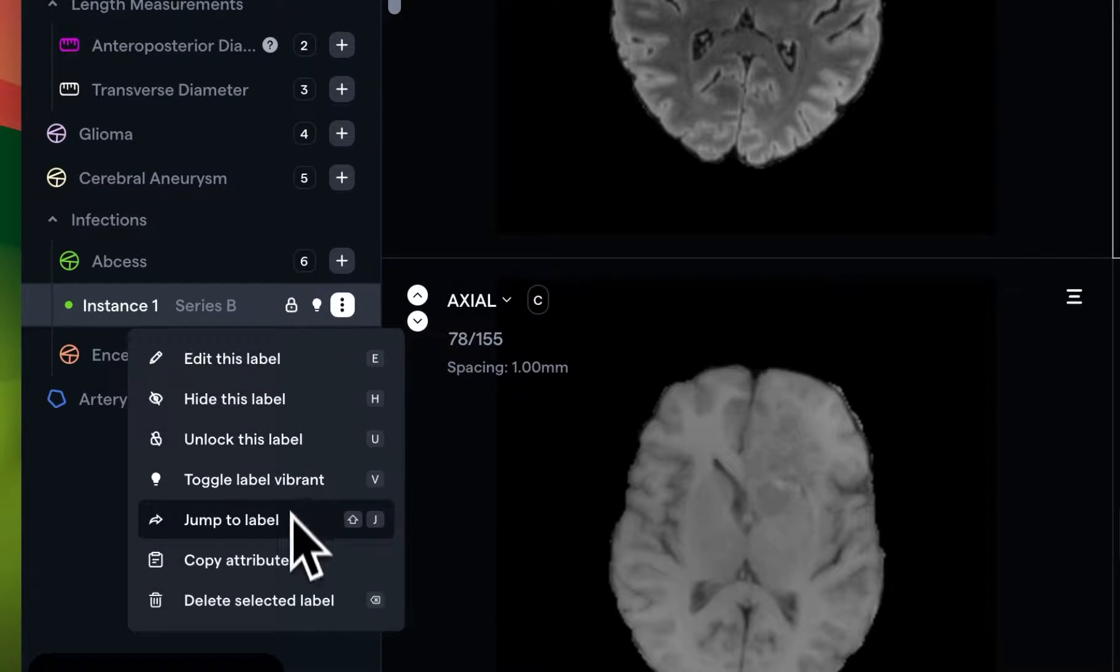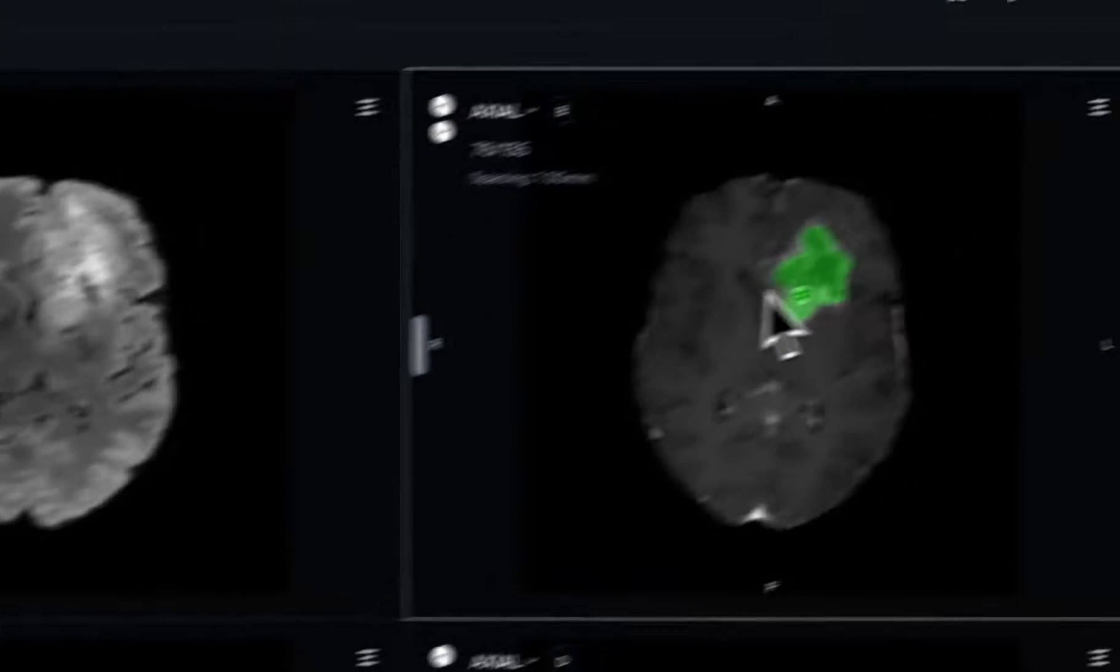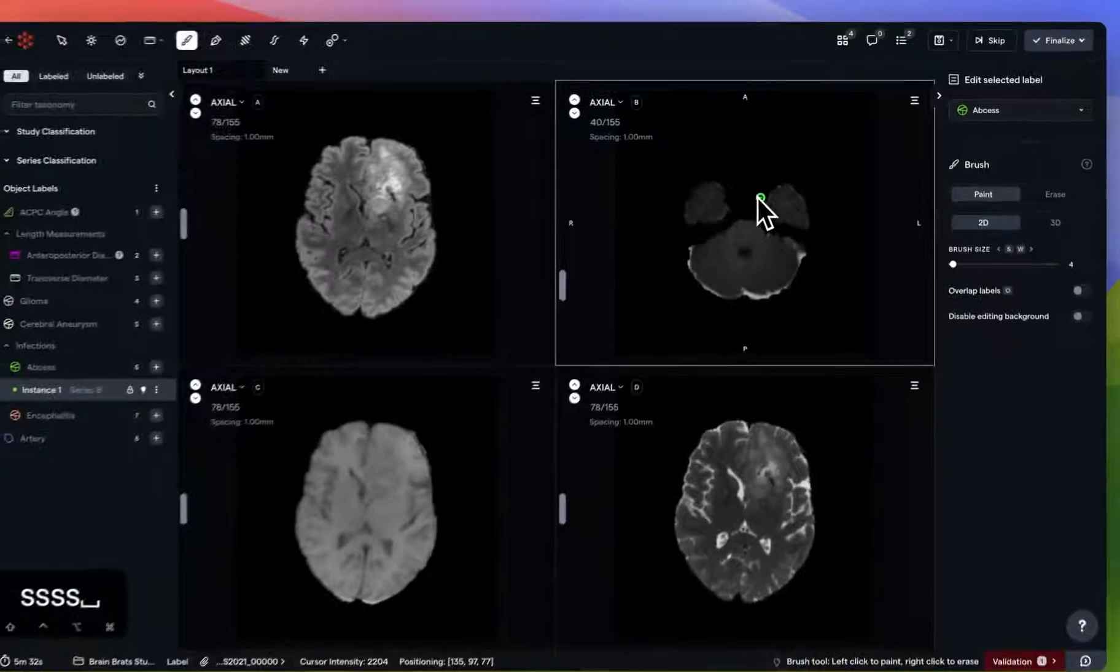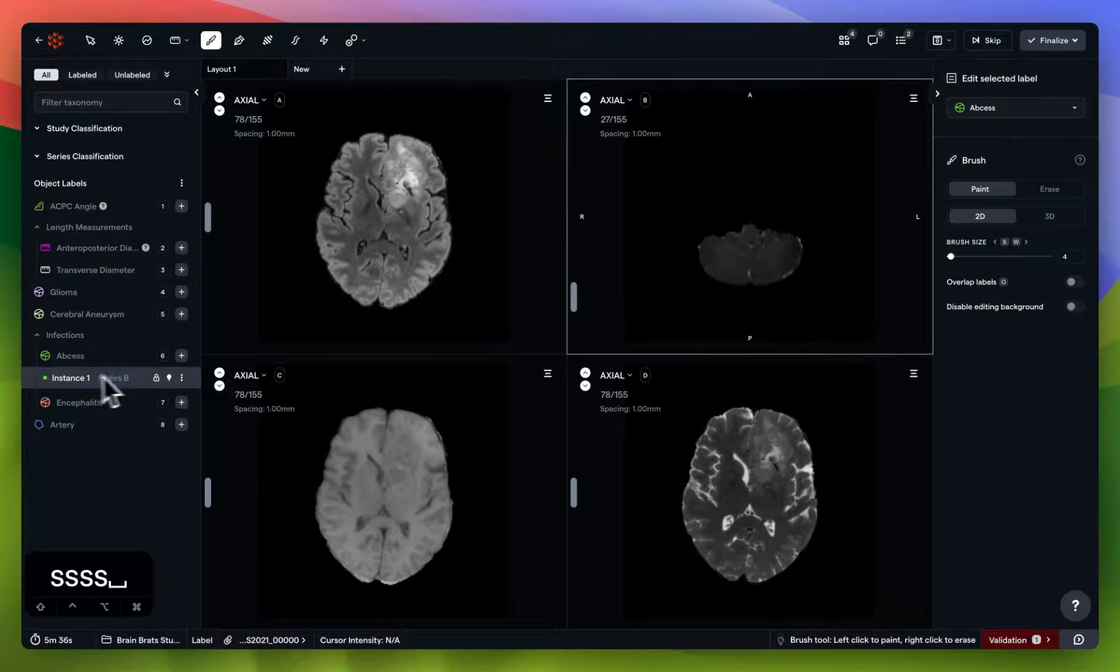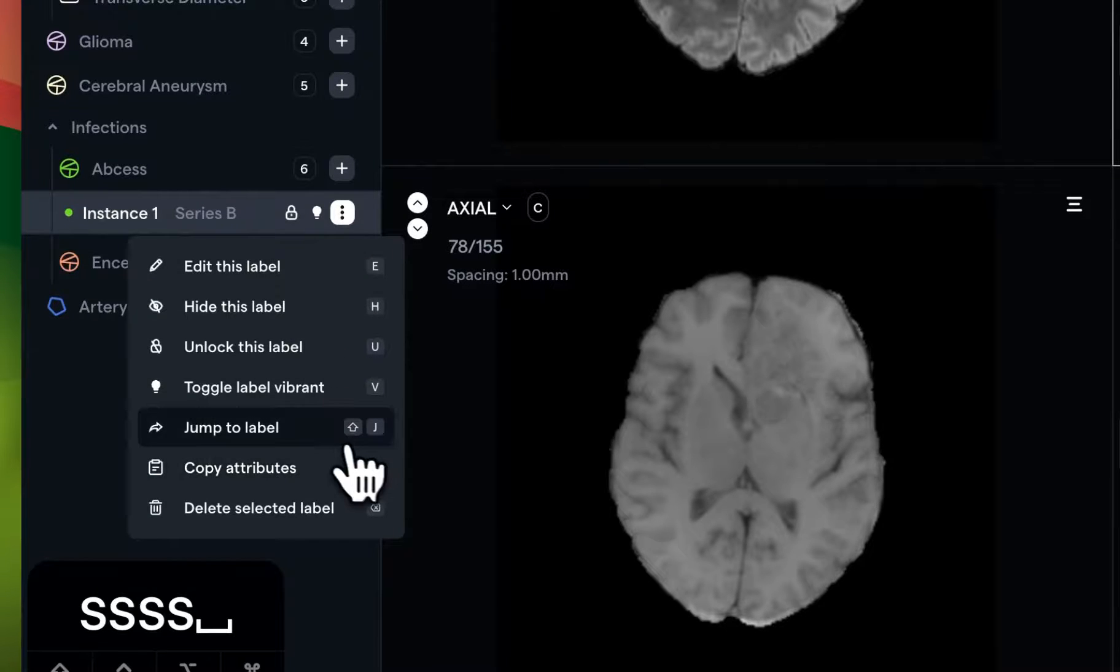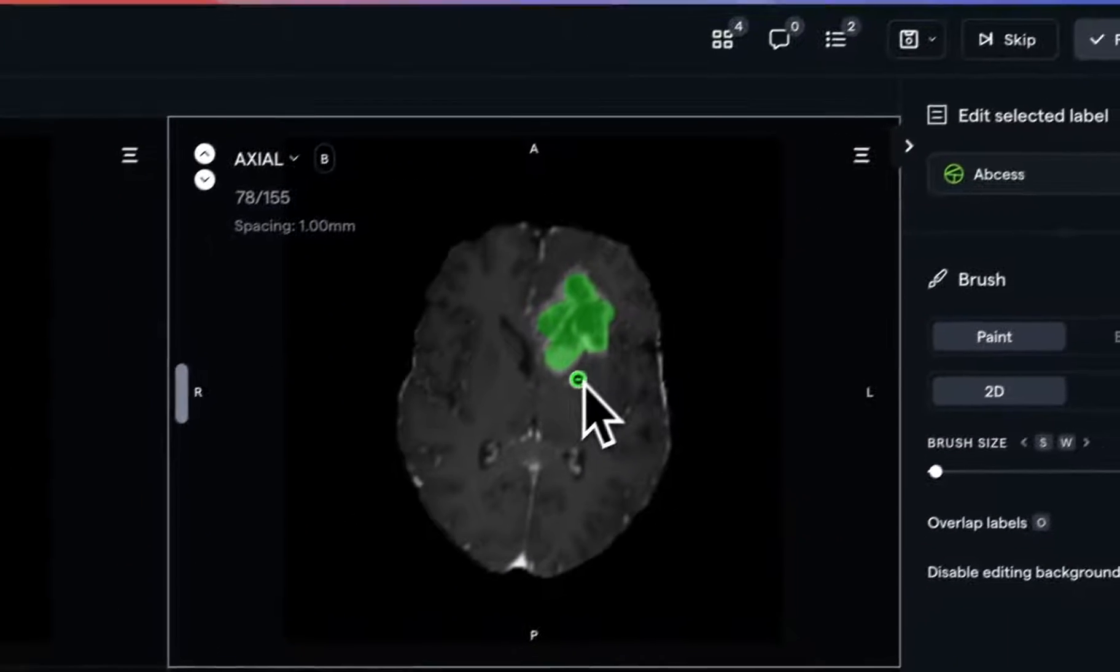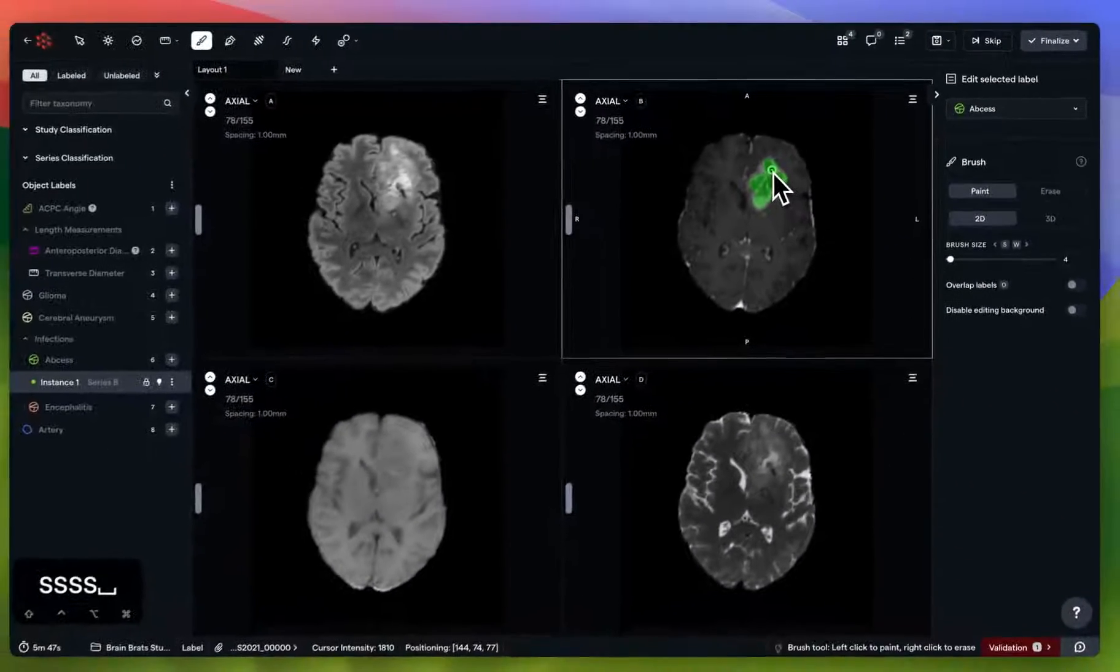And one other very important one is jump to label. So for example, if I was working on another part of this image, and I lost track of this instance, all I have to do is open this hamburger menu here, or just hit Shift J, and that will teleport me immediately to the nearest slice containing this instance.